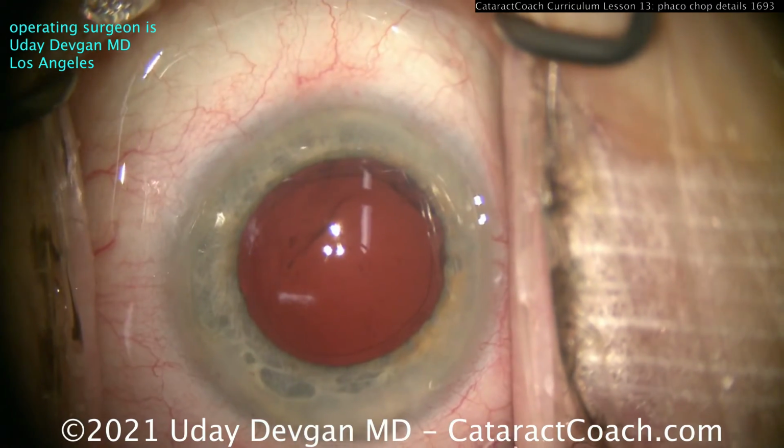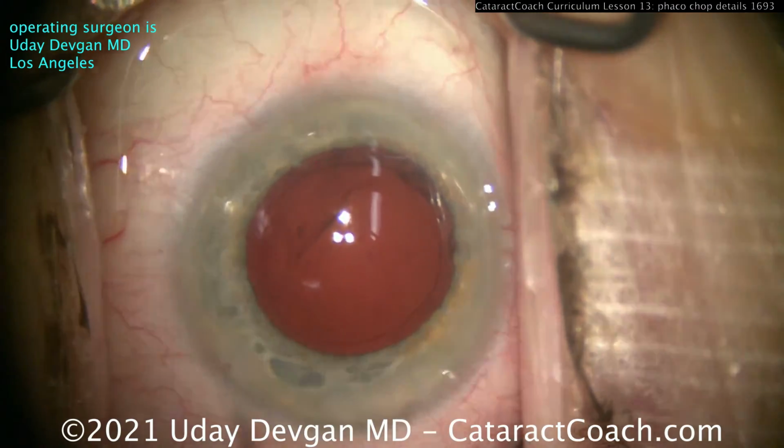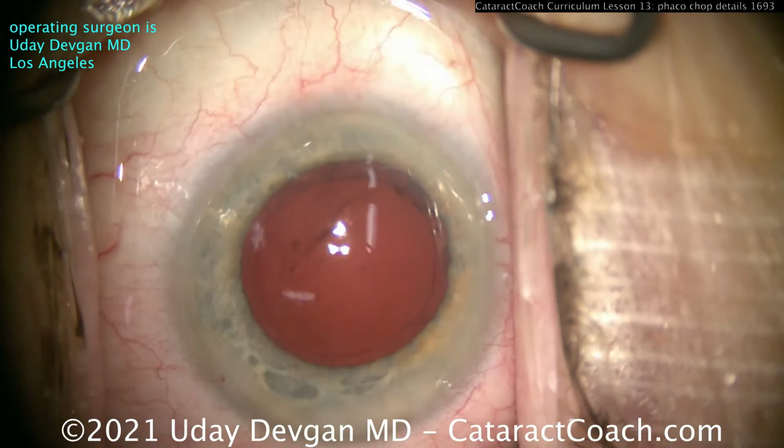So now we're just cleaning up there. Look at that empty capsular bag. Let's fill it up with our cohesive viscoelastic. We'll finish up this case.